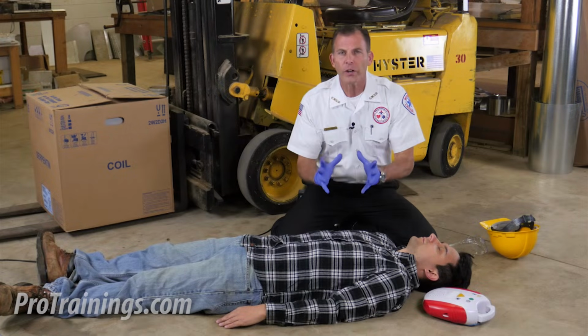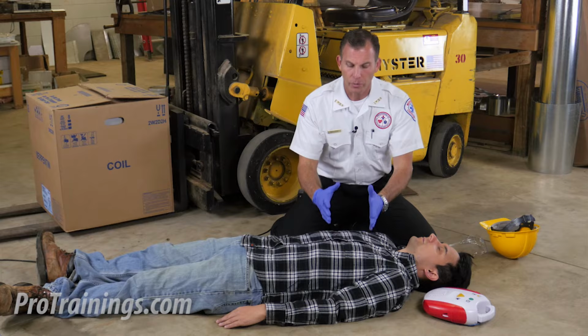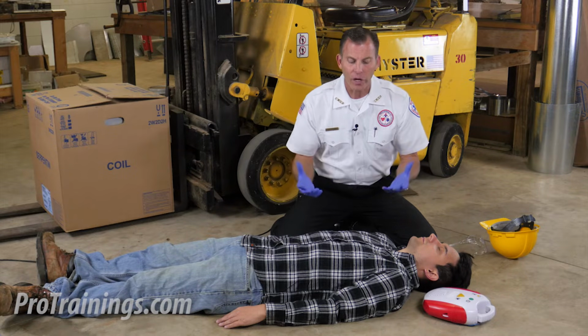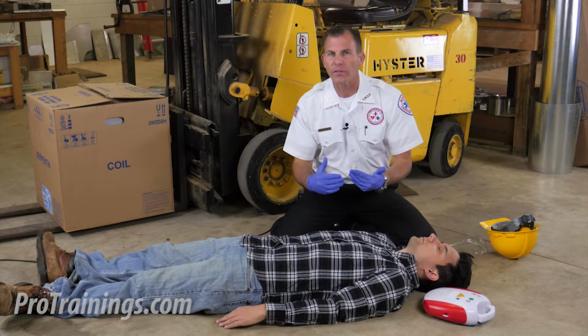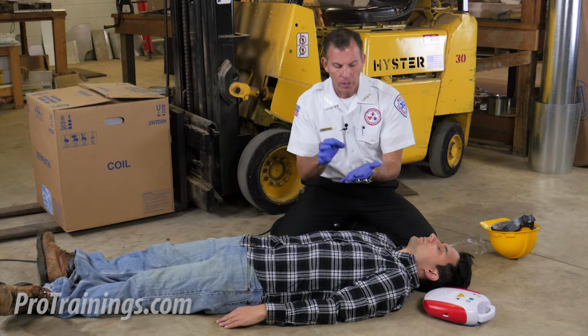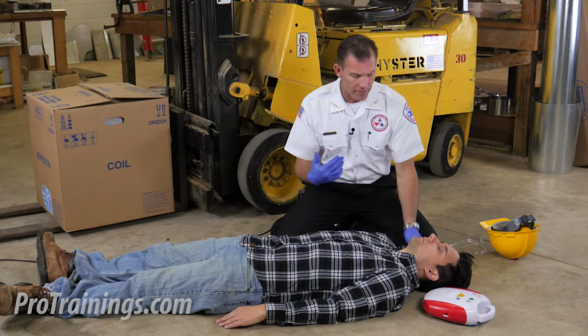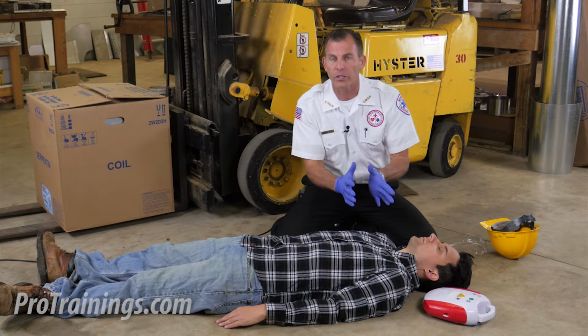Okay, so now in this scenario, we're dealing with the adult victim who's in cardiac arrest with an AED. And before we get started, we need to talk about scene safety for a moment. Is the scene safe? We have our gloves on, we have our CPR shield, so we know the rescuer's safe, but are we safe to use an automated external defibrillator?